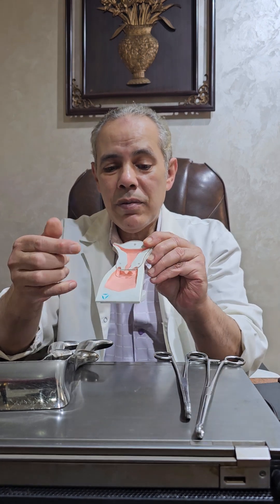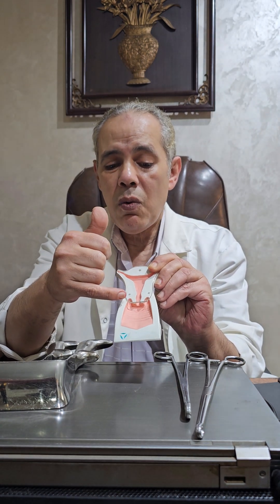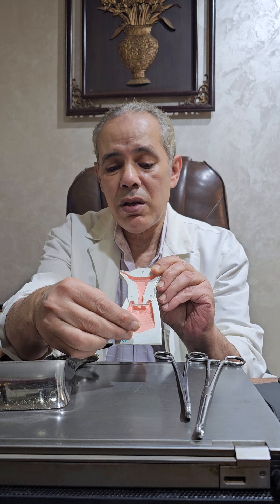Imagine this is the uterus, this is the cervix. After applying the vaginal retractor, we are going to apply the ring forceps — the straight ones — on the anterior and posterior lip.